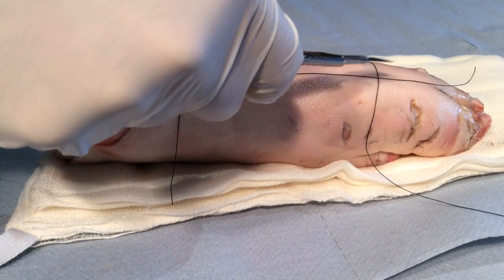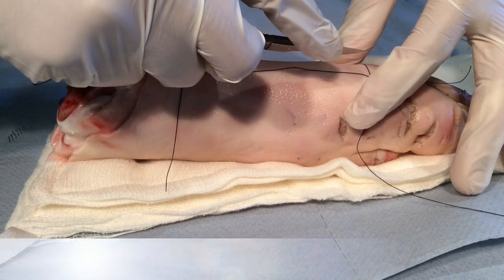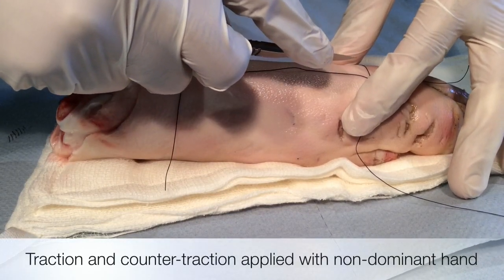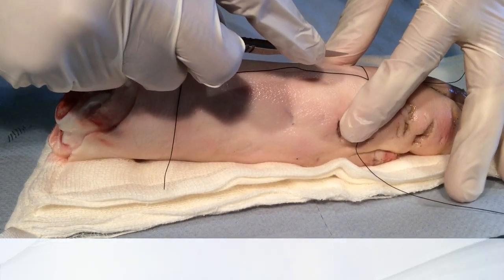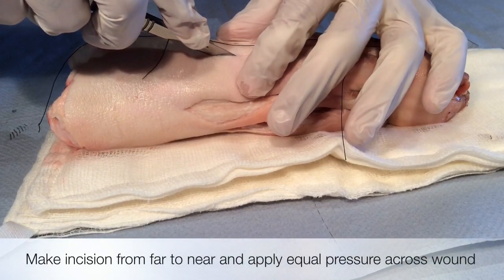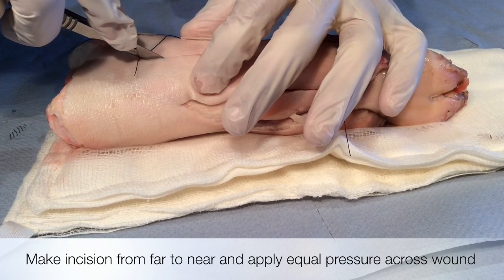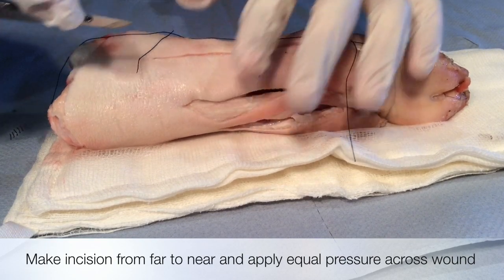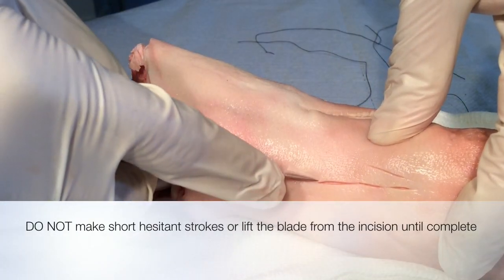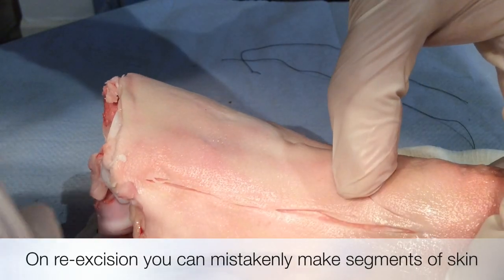To summarise: line up your incision using suture material or marker pen. Use traction and counter-traction when making the incision. Make the incision from far to near. Do not lift the scalpel from the wound. Apply equal depth of pressure as you incise. Do not make short, hesitant strokes, as this can lead to the formation of segments of skin.